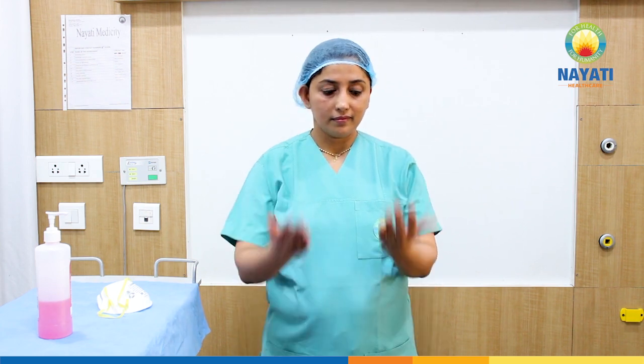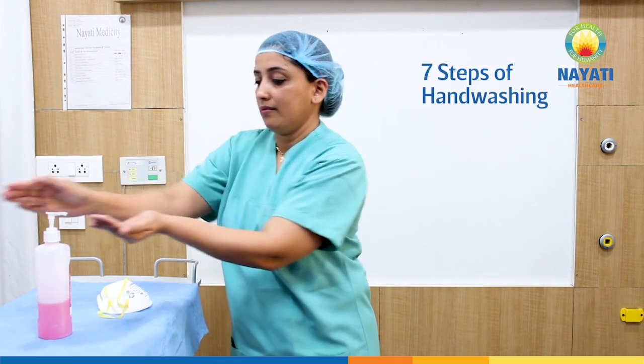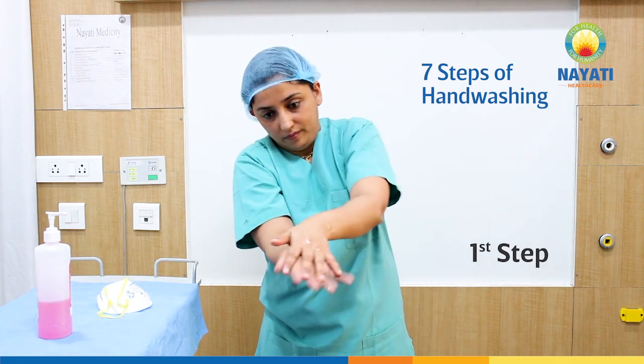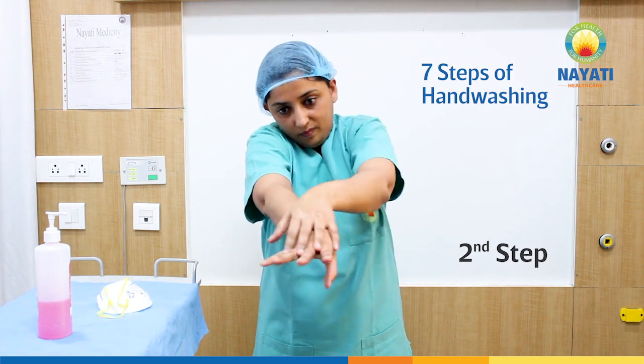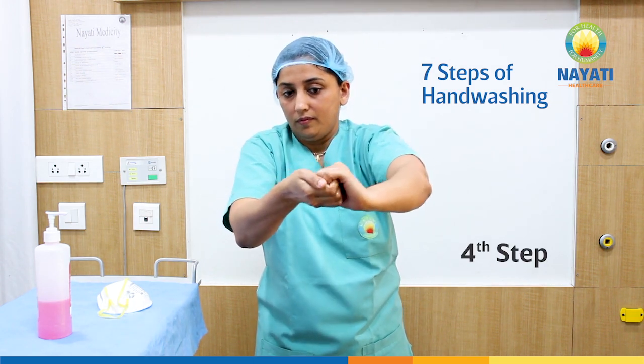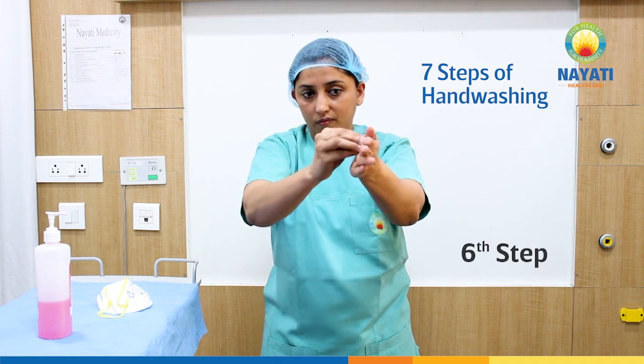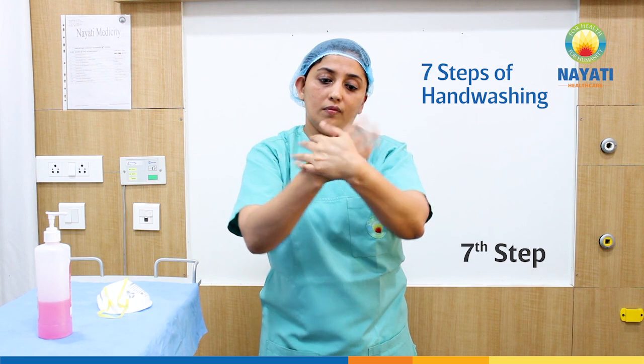Now we will discuss, and my ICN will demonstrate, how to use an N95 mask properly. Before wearing the N95 mask, it is advisable to remove all personal items like jewelry and watch. Then perform hand hygiene with an alcohol-based hand rub, using the 7 steps and giving adequate time of about 20 to 30 seconds. Once the hands are dry, they are fit for use.